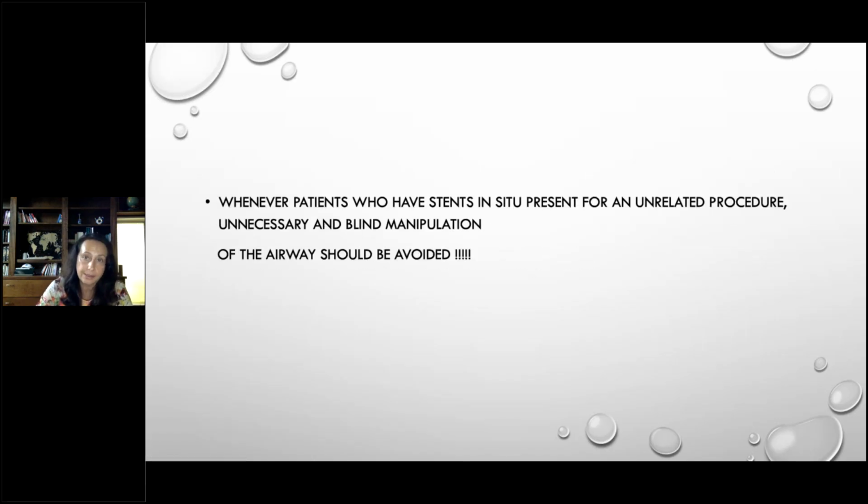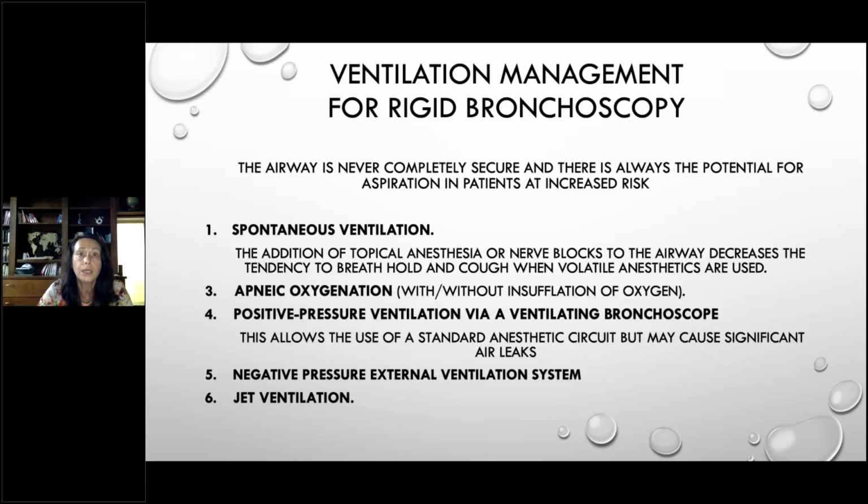If the patients have stents, it is very important not to manipulate the airway blindly. So it all has to be done under direct vision. So no endotracheal tube should be placed blindly, only with a fiber optic scope. And the anesthesia colleagues should be aware of that. If you don't warn them, sometimes maybe they wouldn't know. So communication, communication, communication.